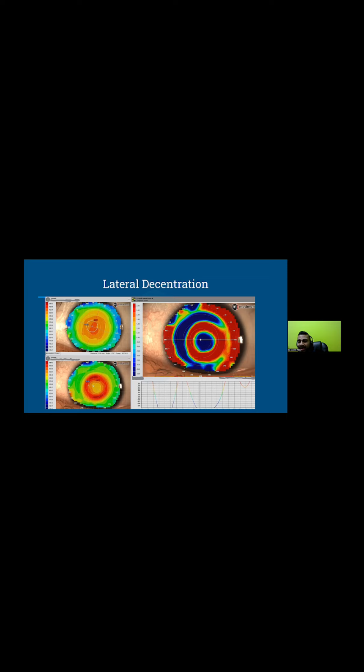So now if you have a diameter that's good or too big, all right, you look at the other curves. But if you're borderline, save yourself the headache. I've done it so many times where I'm looking at topography and the fluorescein image. You could look at this topography if you just want to see some insight in how I'm thinking of how to modify this, okay? So first thing I'm looking at, all right, centrally, yeah, I got a nice blue ring centrally. So they probably should see pretty well. I got a nice red ring in the peripheral. I probably got my peripheral myopic defocus good.